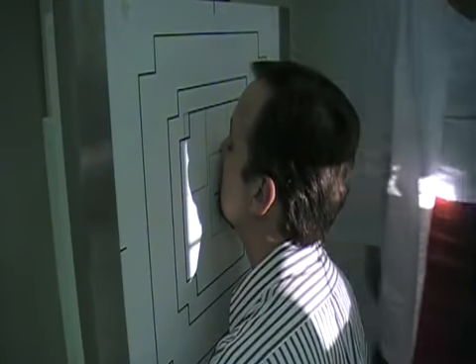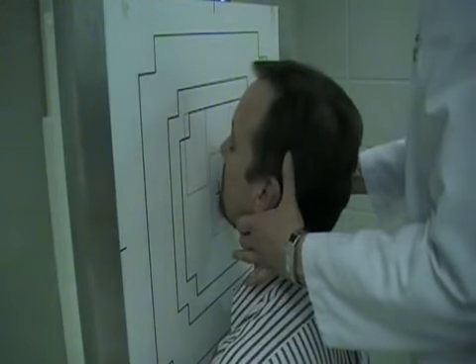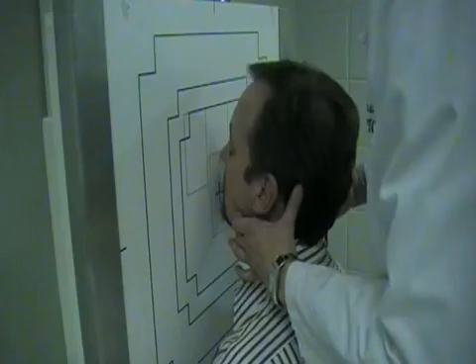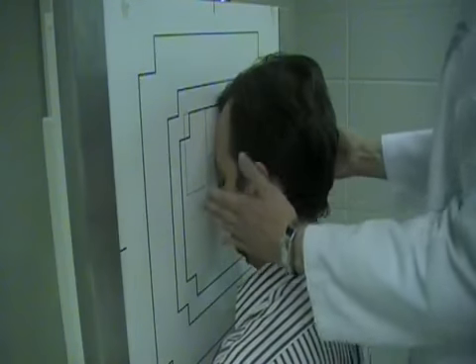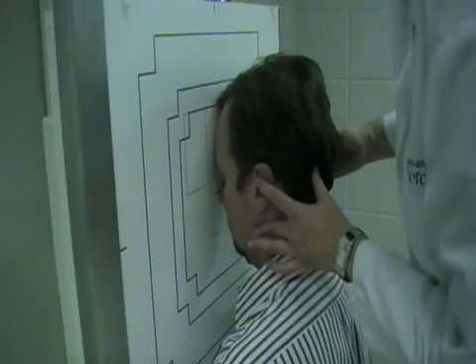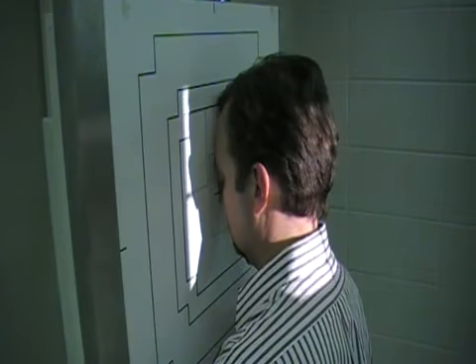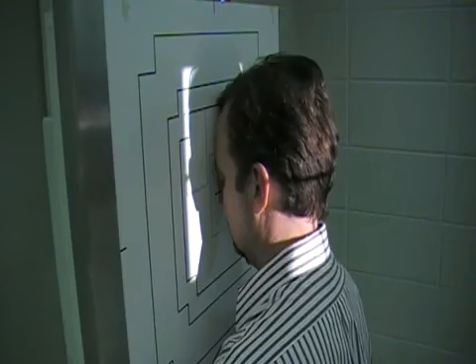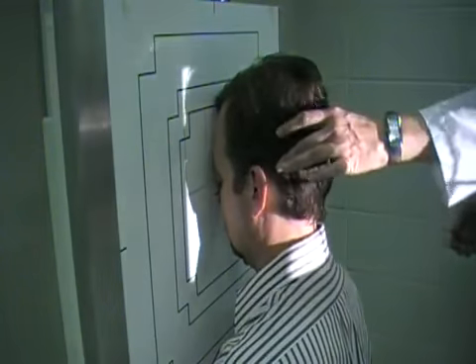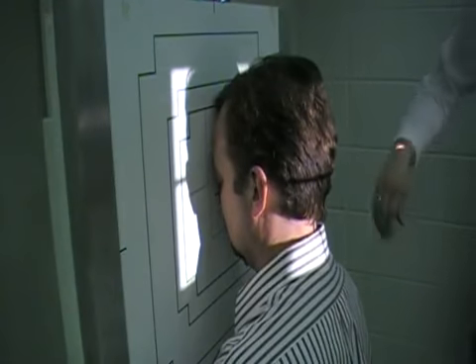We're doing positioning for the mandible, and we're doing the essential projection for the mandibular rami. I'm going to put the forehead and nose up against the board. Check and make sure that there is no rotation. Okay, and then our central ray is going to enter the posterior aspect of the skull, but it's going to exit out at the acanthion.